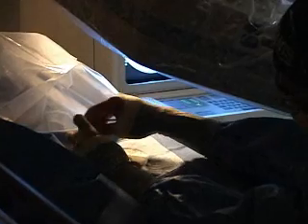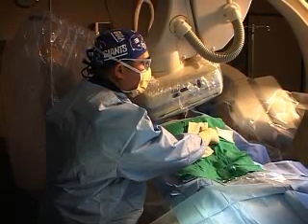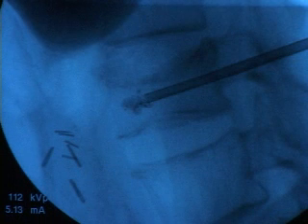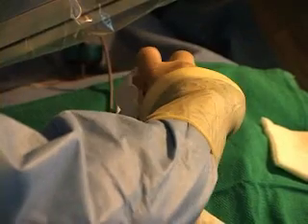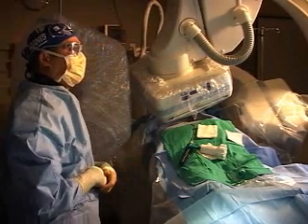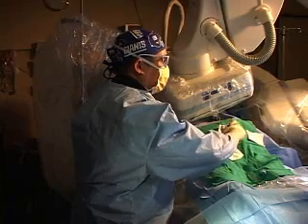The key when you connect these is not letting the cement get introduced with the threads. I've ejected about 1.5 cc. I think I'm actually going to hold it there. I'm going to get a little more anterior filler.